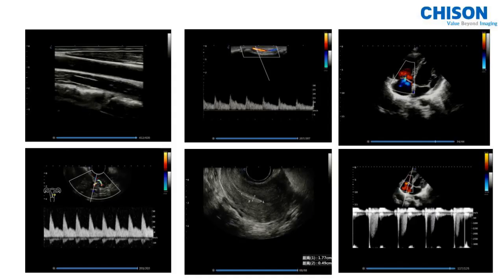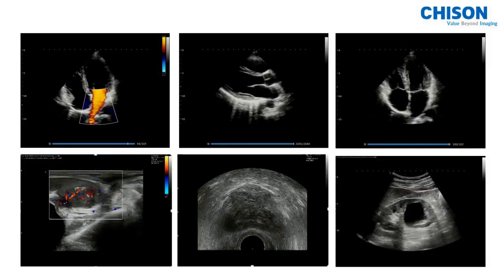Here are some great images the XBIT-90 generates. We have a carotid artery, cardiac, and uterus. Just look at how sharp the images are — the edges are quite clear and the detailed information can be read easily.